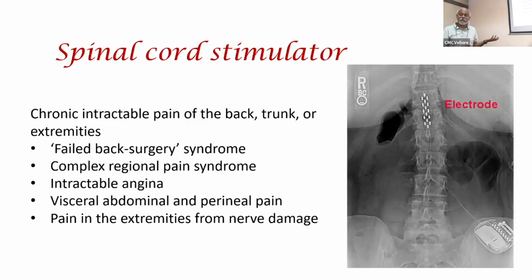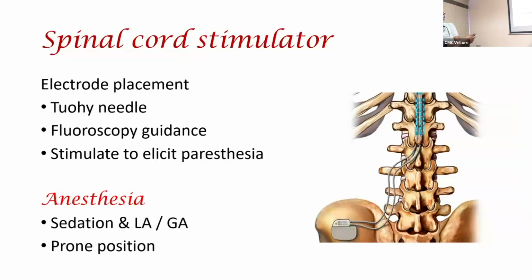Even intractable angina, it has been suggested for stimulators. They used to do it, not so common now for some reason. Or it can be pain in the extremities from nerve damage. I'd say traffic accidents, they can do it. So basically, what they do is a Tuohy needle, the epidural needle, is passed, and these electrodes can be passed inside.